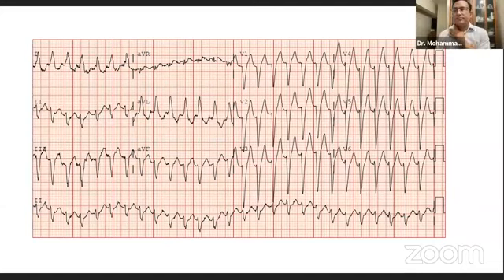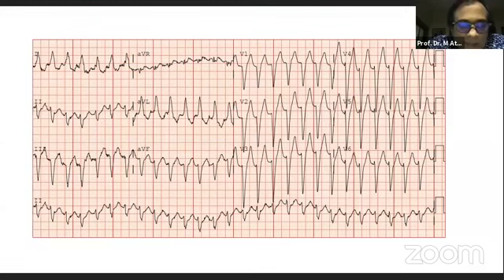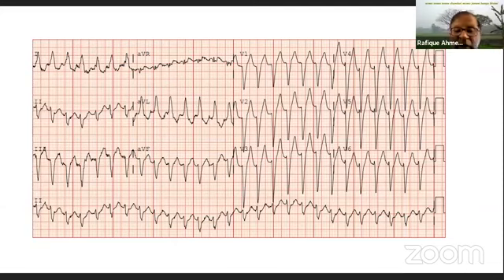Athar bhai: this is an AV nodal dependent tachycardia, wide complex tachycardia, from your adenosine test. Why is Athar answering? Why not one of the young doctors? But since Athar bhai said something, I would request the junior faculty to note how carefully he chose the word. So this is what you do: always, don't let the EP or anybody intimidate you. Say regular wide complex tachycardia, and then start the discussion. Let the big boys take over.